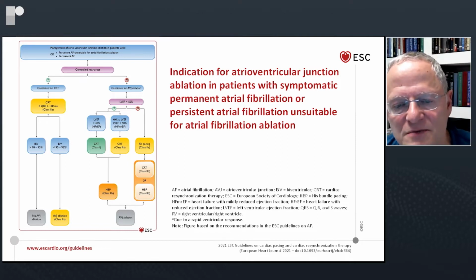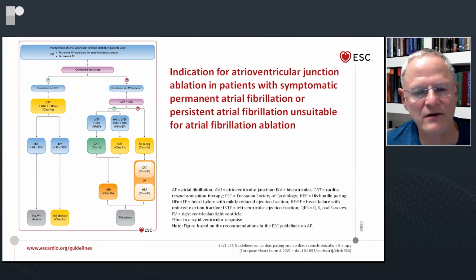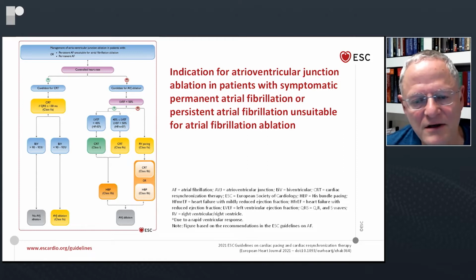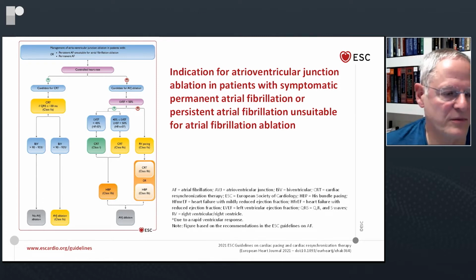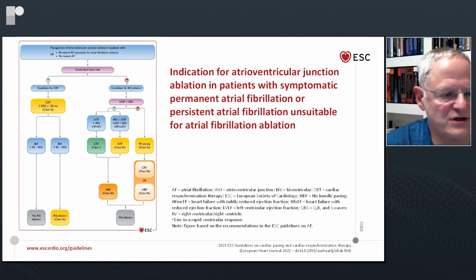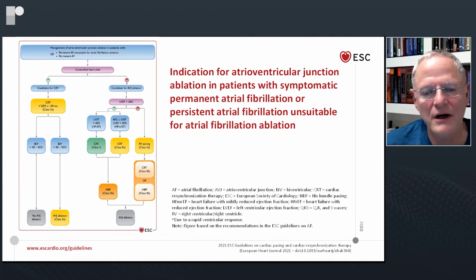If the ejection fraction is below 40, then the first recommendation is for CRT. It's a different level if it's below 50 or below 40, but generally speaking, with ejection fraction below 50%, CRT is recommended, and a lower level of recommendation is given to His bundle pacing because of lack of evidence so far. But anyone who starts with an ejection fraction lower than 50 and is going to undergo AV nodal ablation needs a CRT according to our recommendations.